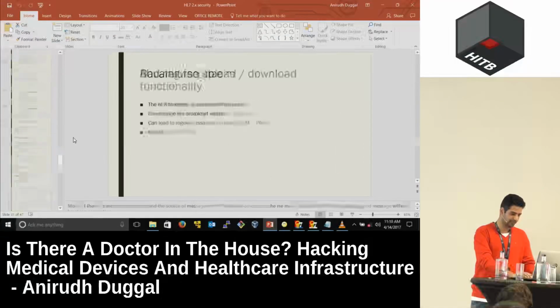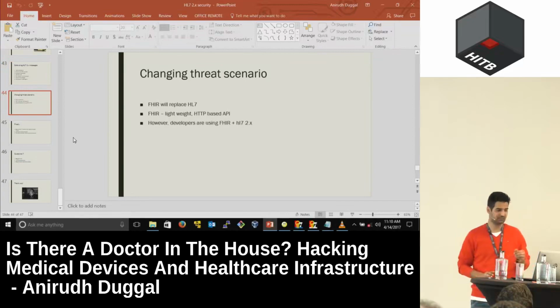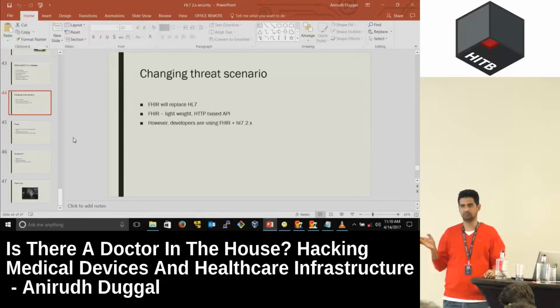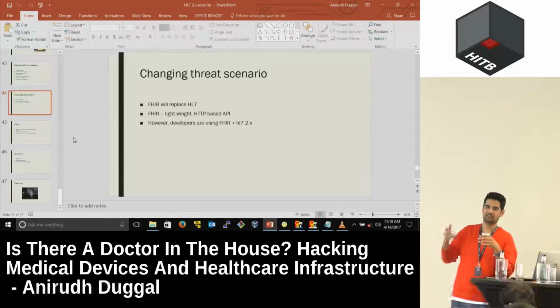Finally, let's talk about FHIR. This is important. FHIR is the next version of what I'd say HL7. And the way it will work is it will replace all of these messages with good JSON content. But the problem right now is that companies find it really hard to migrate on all of it. So they have FHIR implemented, but they are wrappers around HL7.